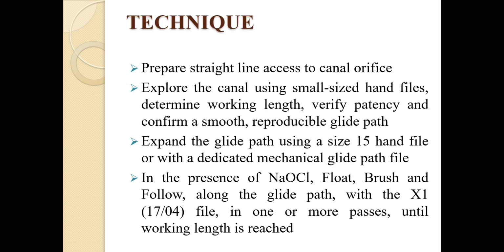Coming to the technique: prepare a straight-line access to the canal orifice, explore the canal using small-sized hand files, determine working length, verify patency, and confirm a smooth, reproducible glide path. Expand the glide path using a size 15 hand file or a dedicated mechanical glide path file. In the presence of sodium hypochlorite, float, brush, and follow along the glide path with the X1 17 by 04 file in one or more passes until working length is reached.